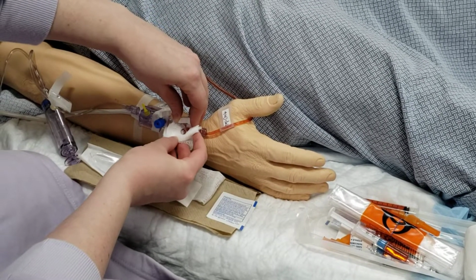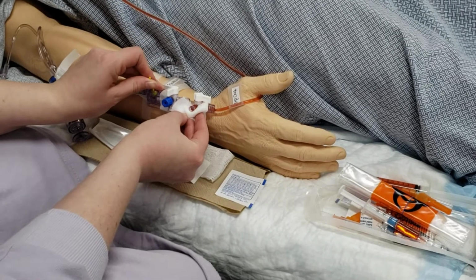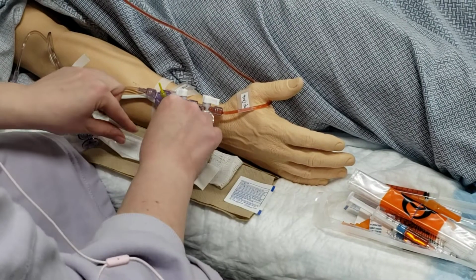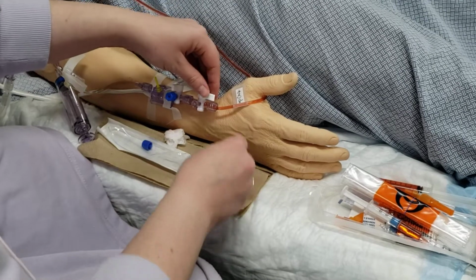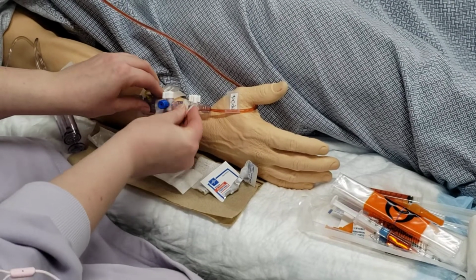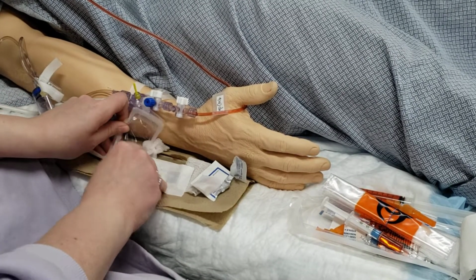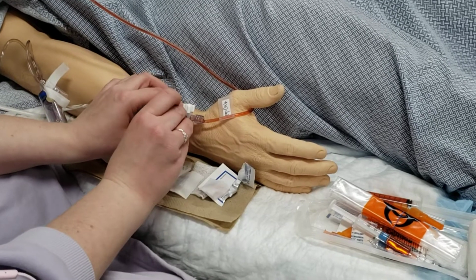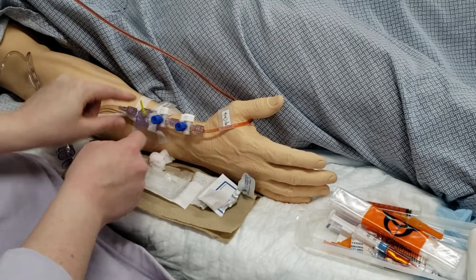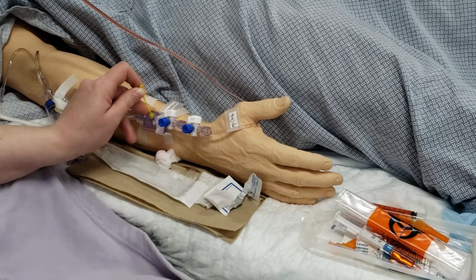Next, I like to take my gauze, flip it off to my patient, pull my pigtail so that my little port is clean, because I like to leave my lines and everything all clean and nice. Off to everything. Take my alcohol clean to prevent any infection or any pathogens I might have exposed. Either take a new cap, or if I was able to leave my cap clean or sterile, cap it. Off to my open port. Come back to my pigtail on my transducer and flush my line until my line is clear of blood to prevent any type of clots in my line.